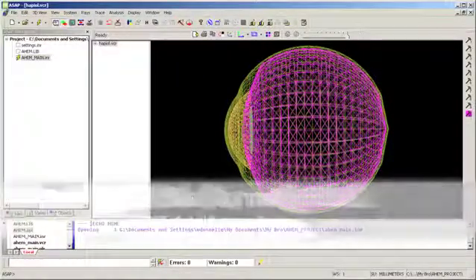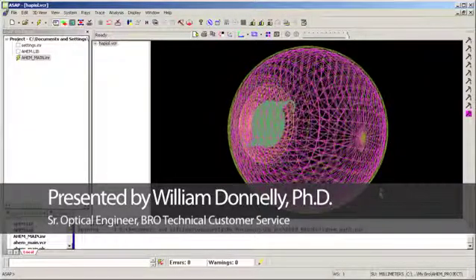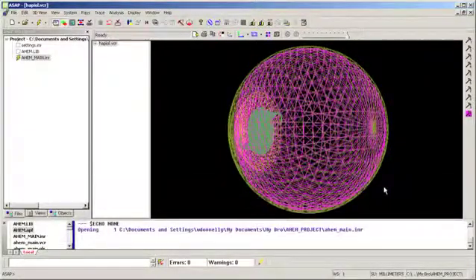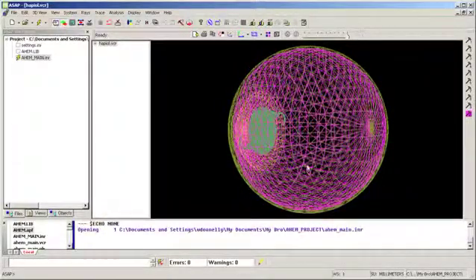We're going to use the eye model to model an intraocular lens now. And then we're also going to visualize the appearance of the intraocular lens from the outside, from the cornea. So let's look at that intraocular lens, which is inserted into the eye first.